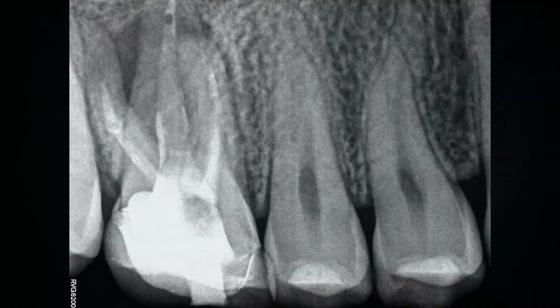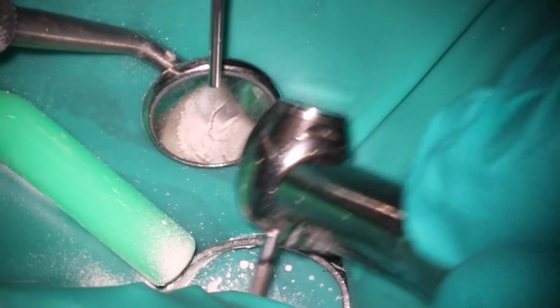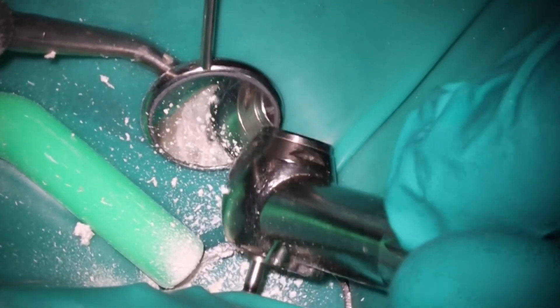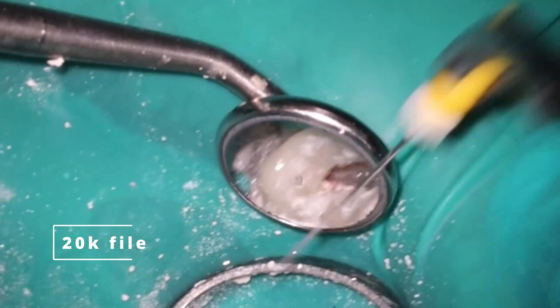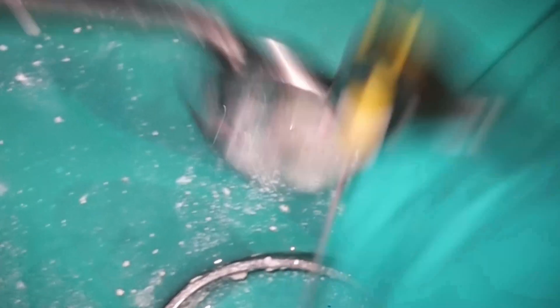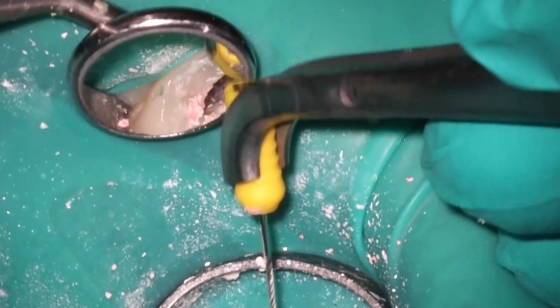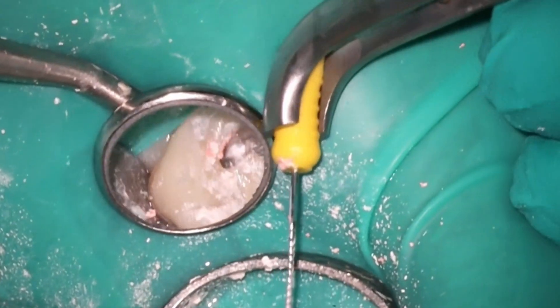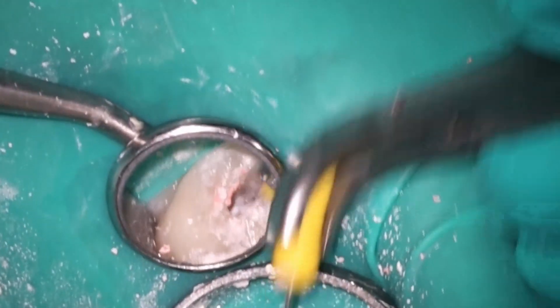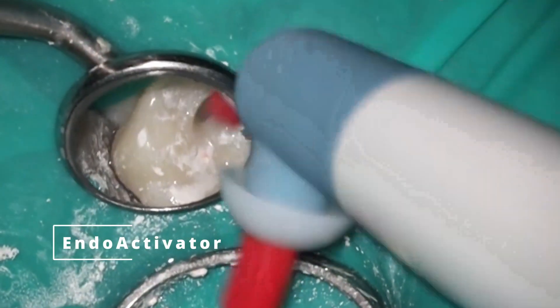It's been a month and he feels great — no more swelling, everything's back. I'm using a larger diamond here because it fit the size pretty much perfectly. As soon as we hit that area where the calcium hydroxide was, it just sprays everywhere. I'm going in with the 20K file to dislodge any loose gutta percha that's been cleaned out by the calcium hydroxide, and to make sure we're still patent with no issues for obturation. If you're struggling with a piece of gutta percha being stuck, throw the calcium hydroxide in, give it a month — when you come back, it's sometimes actually loose.